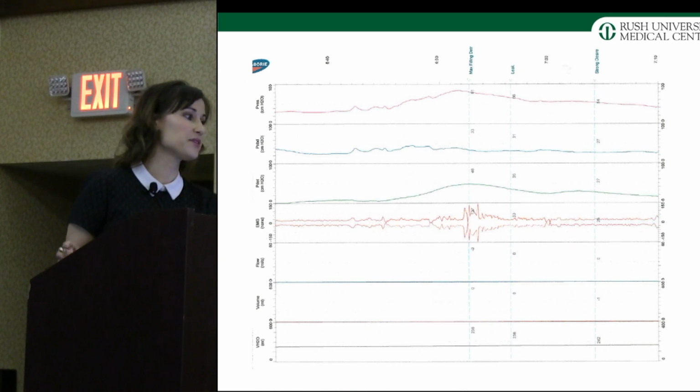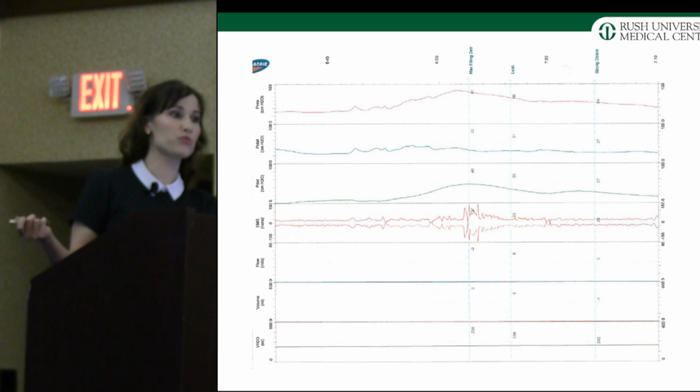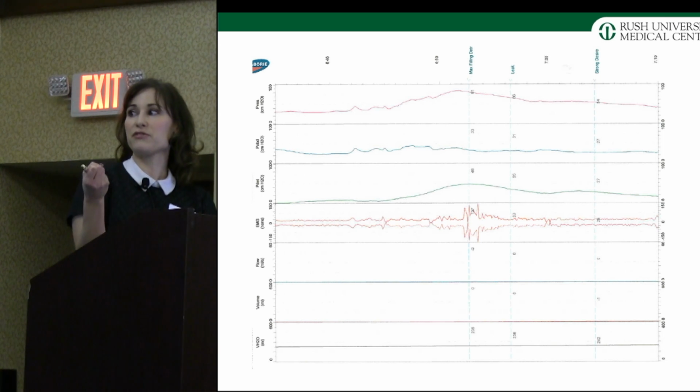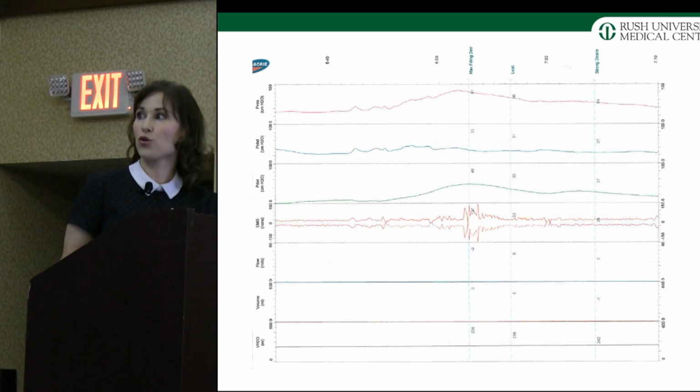And then again here, this is our abdominal catheter, completely quiet. The patient's having an uninhibited contraction. We have a rise here in the detrusor and the vesical pressure. This is a little bit of what we call guarding, and that's a normal response. They're feeling like they have to go, and they're holding their pelvic floor in an effort to keep from leaking. So that's a normal thing that you'll see.